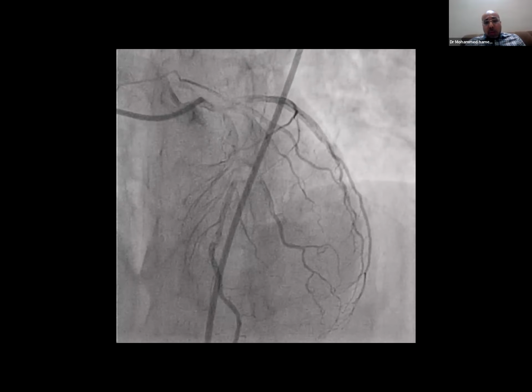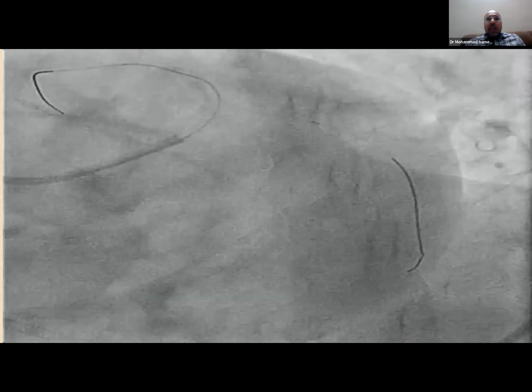We decided to complete the revascularization now. First of all, this patient is 75. She's not a candidate for surgery. Second, she's an Umrah patient, and there's special circumstances that you need to finish the job in a shorter time to catch their Umrah and go home. And of course, I know this will be an area of debate to do this lesion at once or to make it staged, but you can appreciate that this distal left main is hazy and thrombotic, and we are afraid that it may close. And of course, this is what causes sudden death.